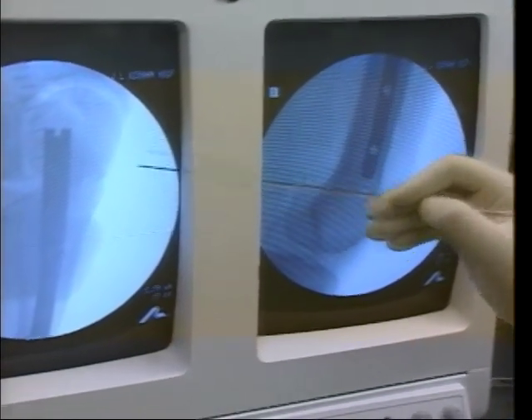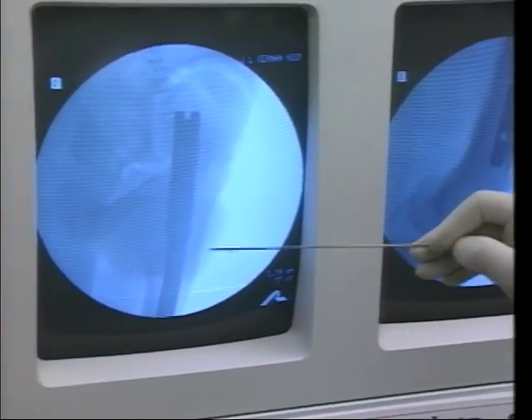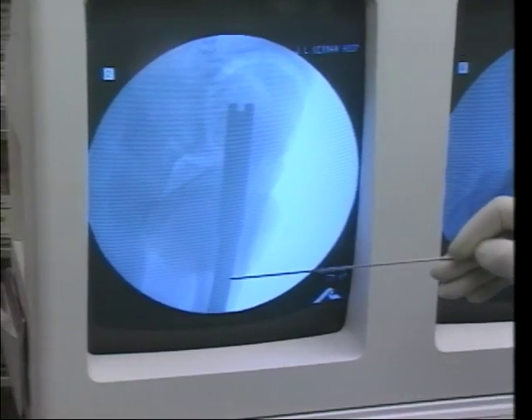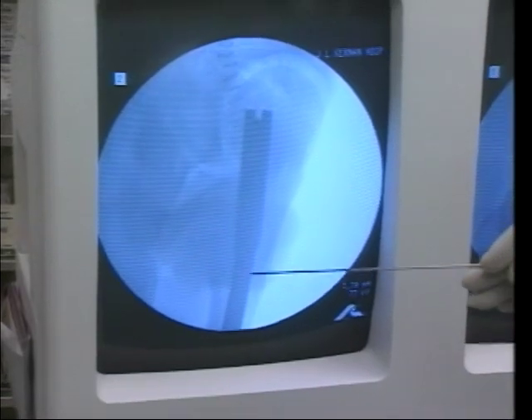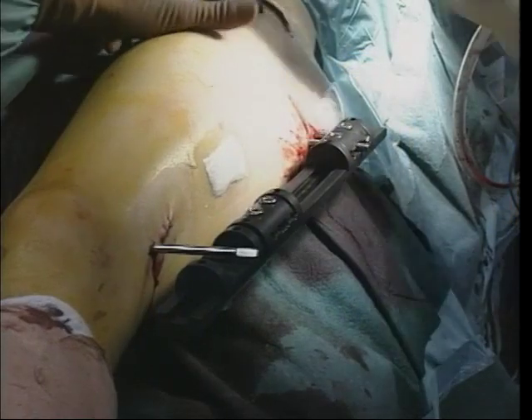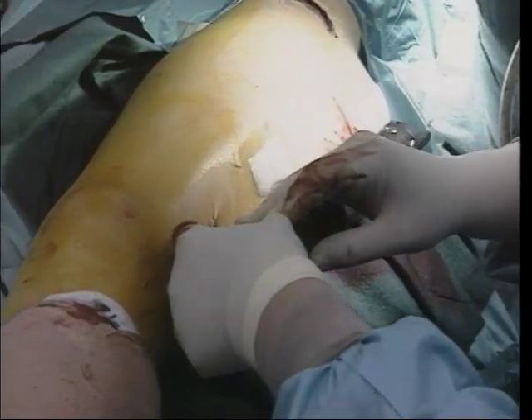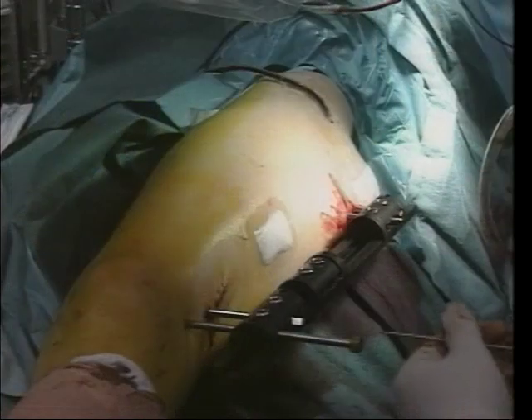In the proximal femur it's a toss-up. We could squeeze two pins anterior to the nail, but here where the lesser trochanter is there usually is a fair amount of room, and you can see that we can get one pin there and one pin there. If we put one or two of these holes in and they're in the wrong position, then we've lost all the space for fixation available.